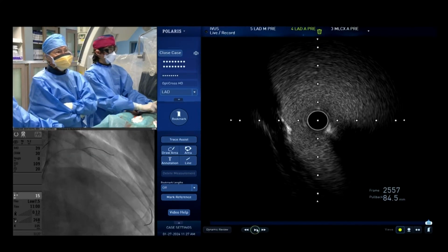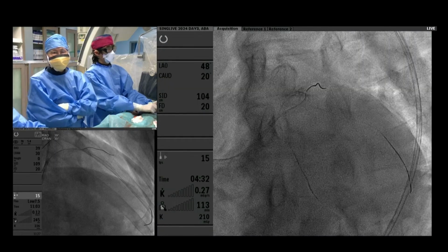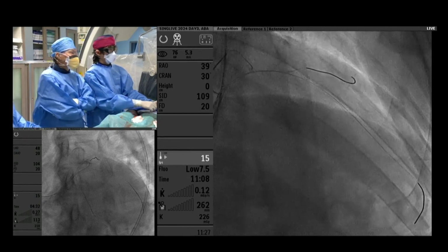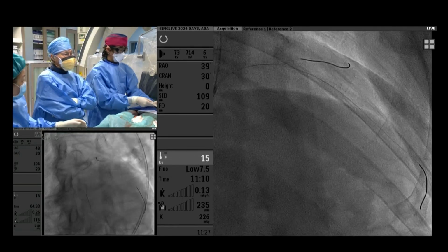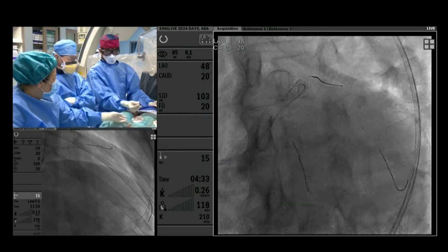If it's still needed, we can still overlap another stent between the two stents. Yeah, and I guess the other reason is because you would worry a little bit about the residual disease in the left main getting in the way of a slightly more bulky drug-coated balloon. Yeah, it's a good consideration, but I think the dilatation is quite good.